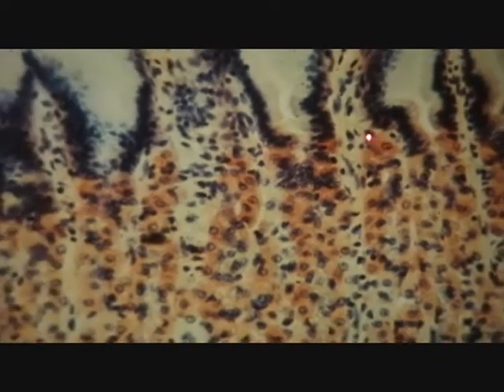All the purple dots are the basal nuclei of those cells. And then down you go into the gastric glands, millions and millions of them, showing singularly this cell, perfect example of a parietal cell.